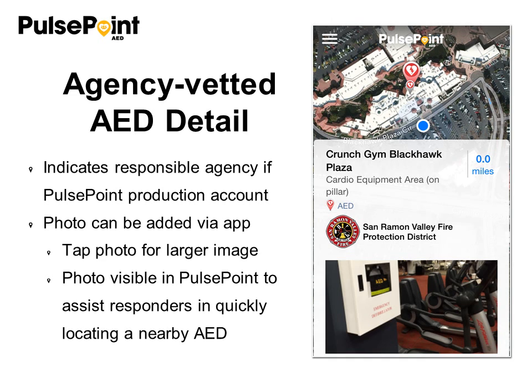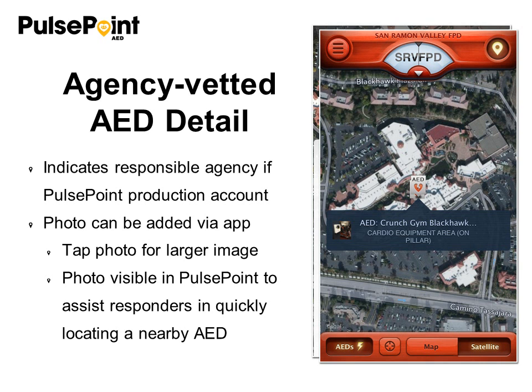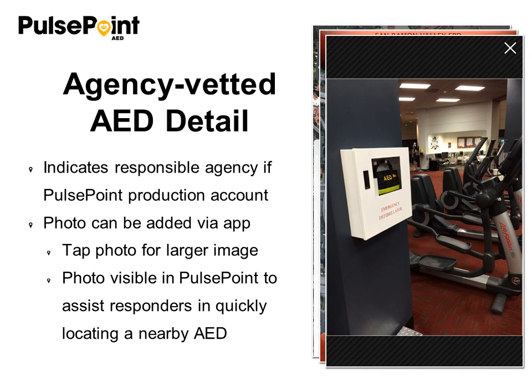Agency vetted AED detail indicates the responsible agency for the PulsePoint production account. A photo can be added via the app. Tap on the photo for a larger image, and a photo can assist responders in quickly locating a nearby AED.